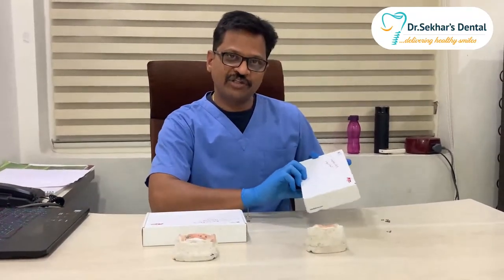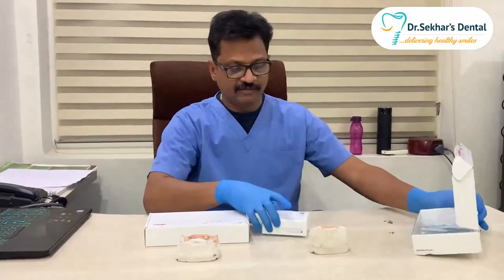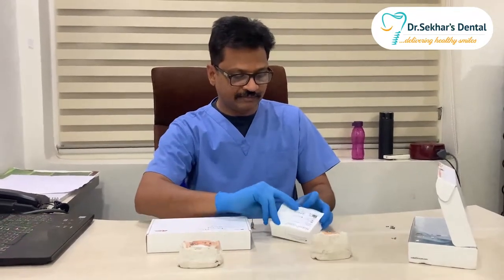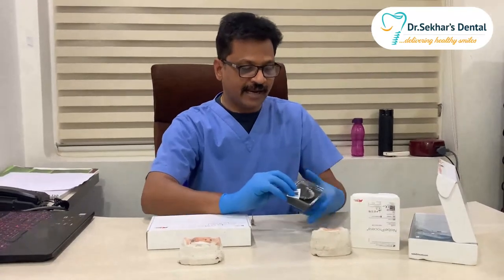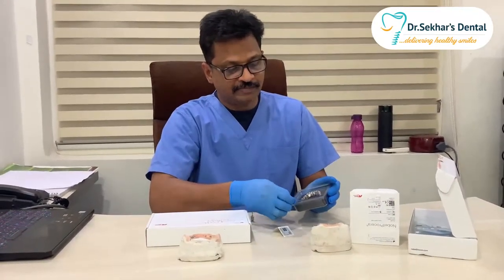This is a Procera frame which I received just today from the U.S., and the frame is nicely packed in this parcel.